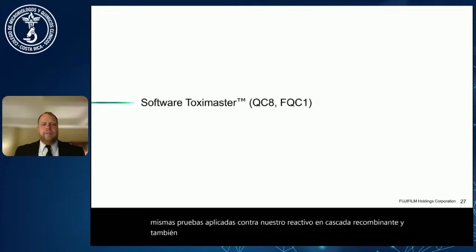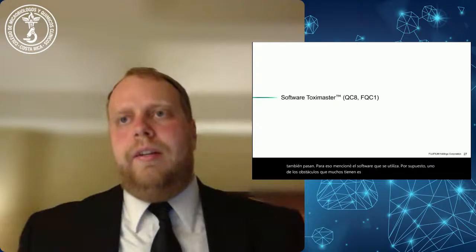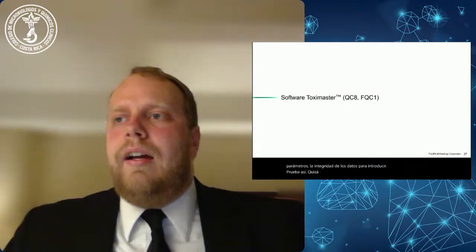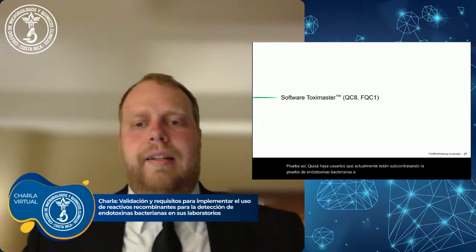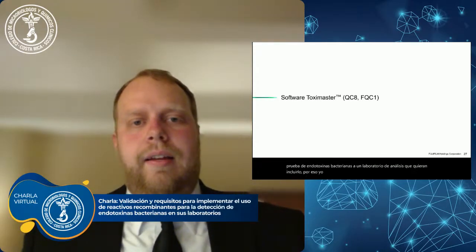I mentioned the software that is used. Of course, one hurdle that many have is just the setting of the parameters, the data integrity for bringing in a test like this. Perhaps there are users that are currently outsourcing the bacterial endotoxin test to a testing laboratory, who would like to bring that inside. And so that is why I would recommend a software.